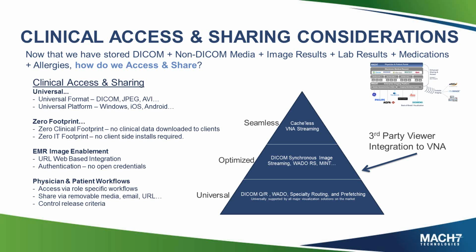Does it require Flash or Silverlight or some kind of ActiveX control to be downloaded? Most of the new viewers coming out today require a modern browser through HTML5, and given you have HTML5, there's zero IT footprint required.